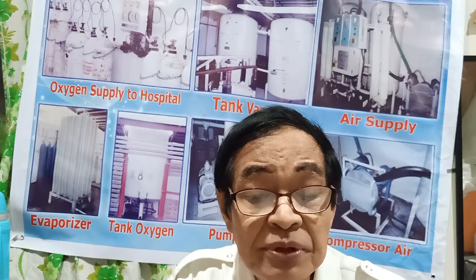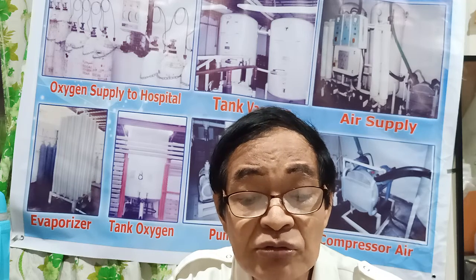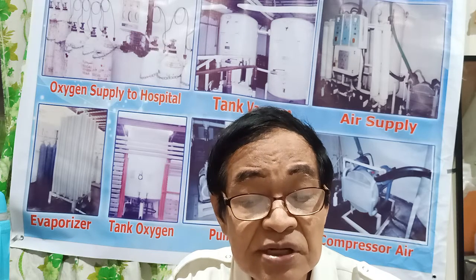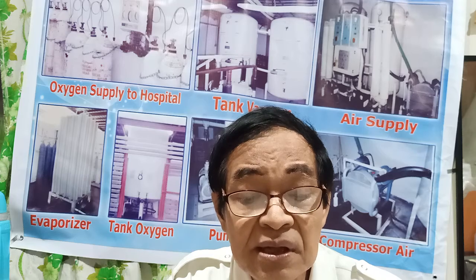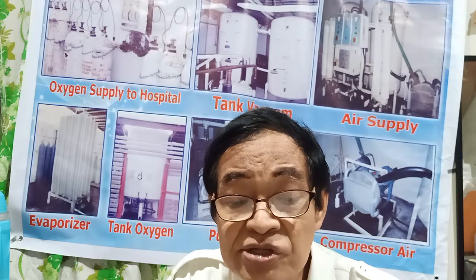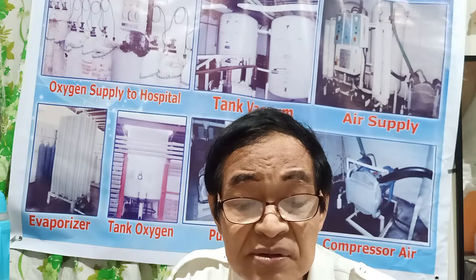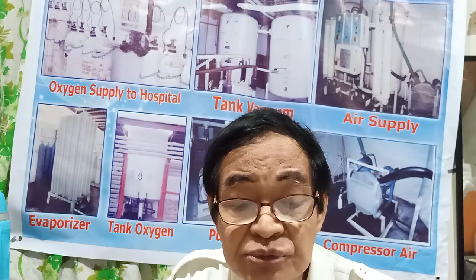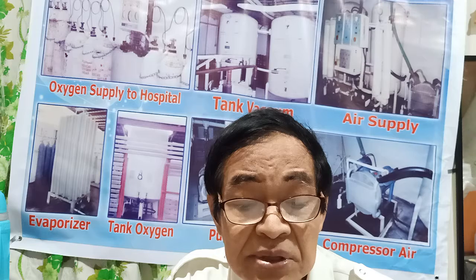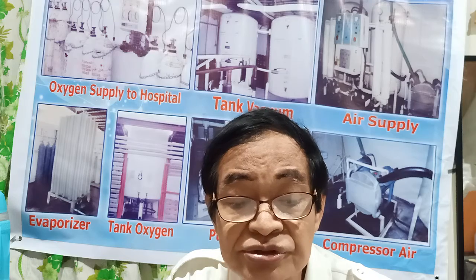The plug at the port of the pipe is a source of risk of pipe bursting, and additional hoses may move violently when an ice plug loosens suddenly. An ejected ice plug can cause serious injury. Never release the pressure in the liquid carbon dioxide hose without first purging the liquid with the gas or waiting until the liquid has boiled off the hose.